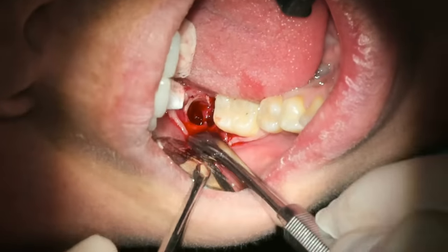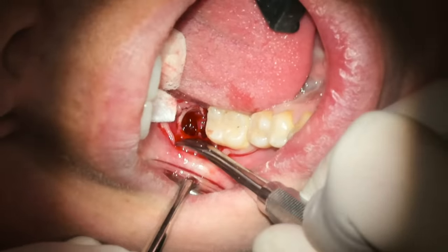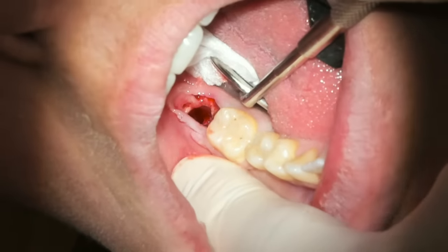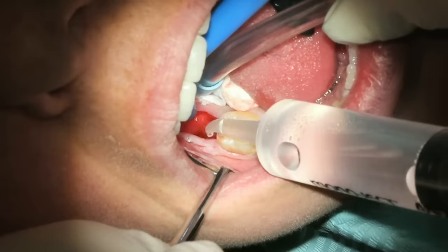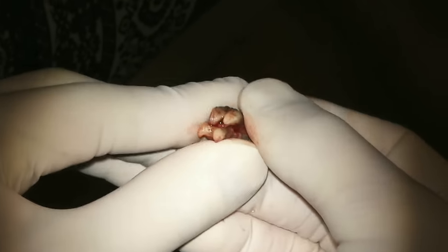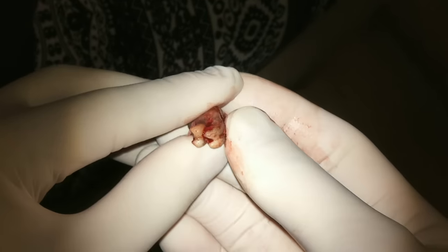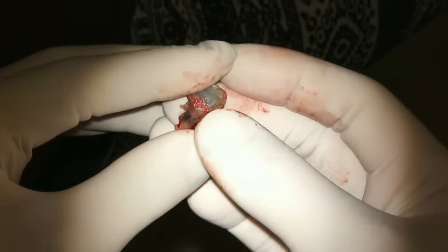Here we're massaging the tissue and trying to make sure most of the infection is out. This step is actually quite uncomfortable for most patients, but it's a necessary step we must accomplish. We irrigate and cleanse the area really well. We take a look at the tooth to make sure we're not missing any pieces. Here we have a four-rooted third molar.